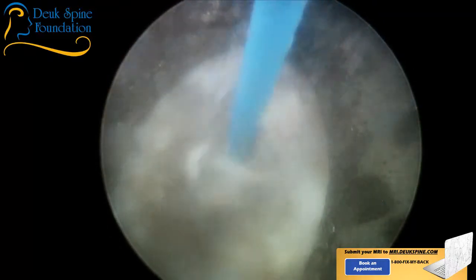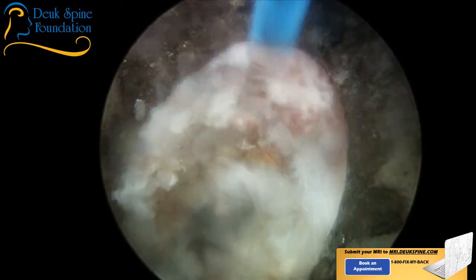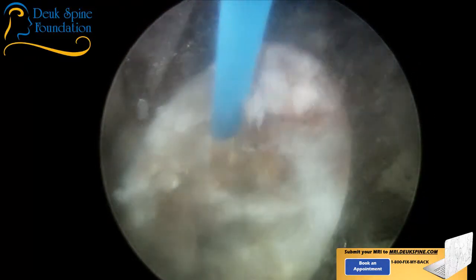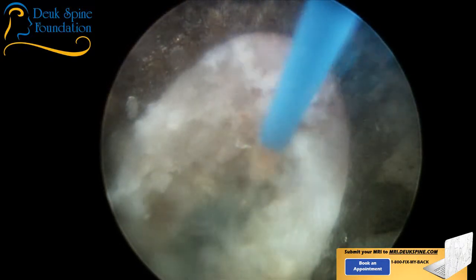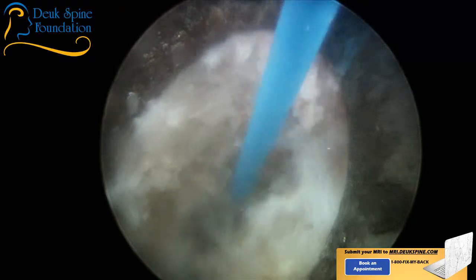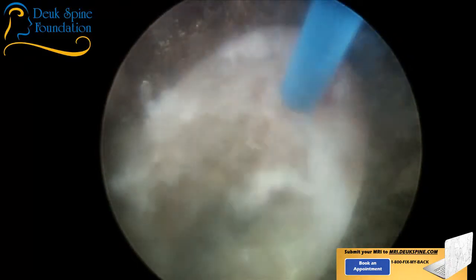You guys ready? Blood pressure's been good? Ooh, it's a little high, huh? All right. Well, I promise you, epidural hematomas are not things we want to deal with here. So we got to keep the blood pressure under control. It's very serious. I don't ask for things unless I really, really mean it.